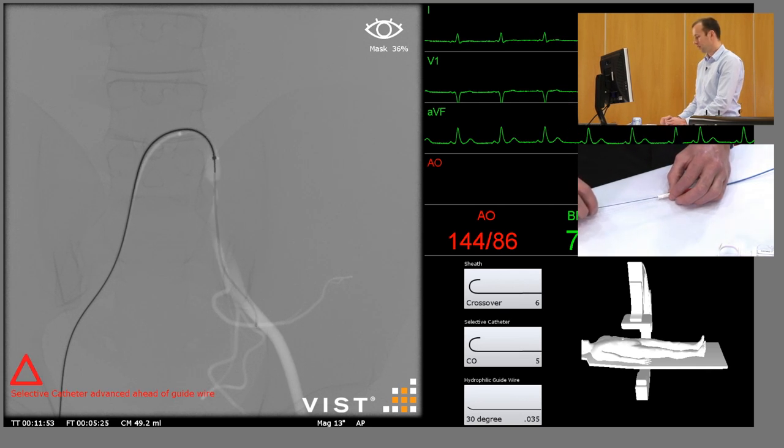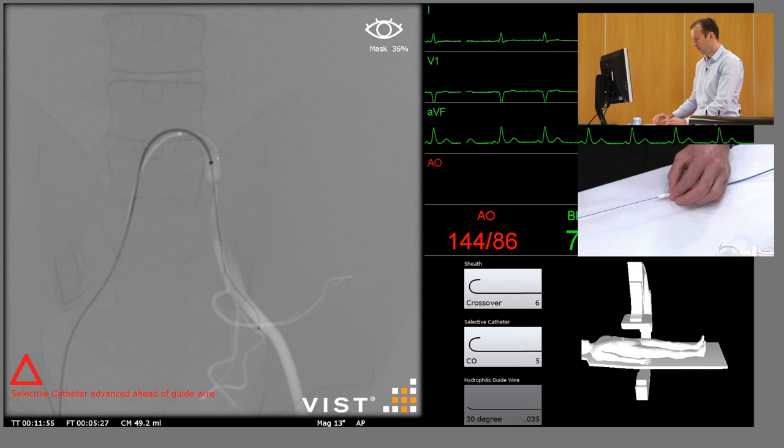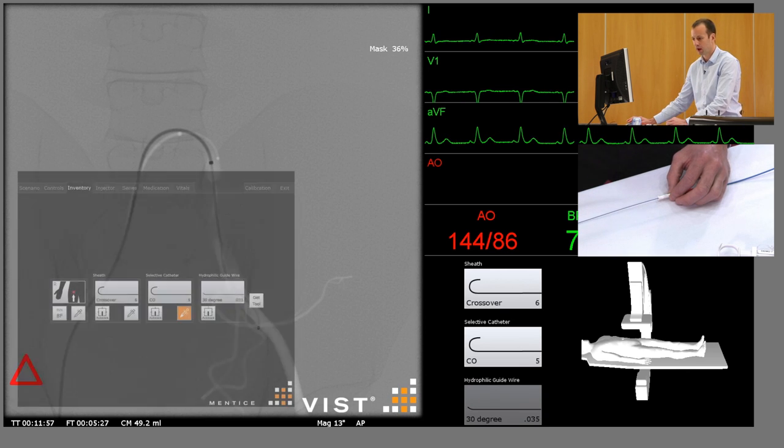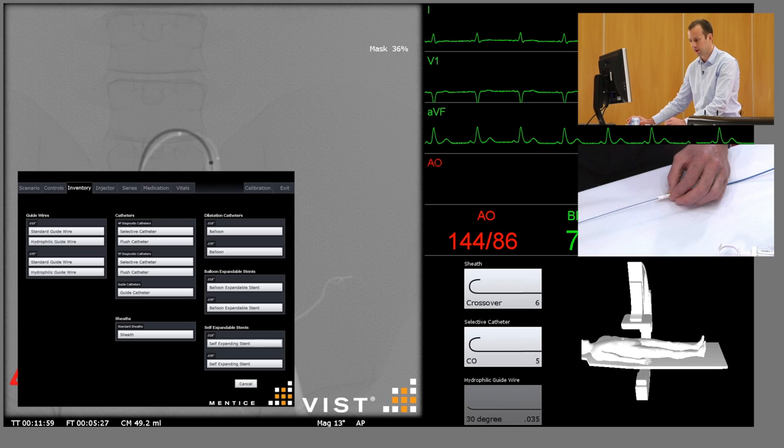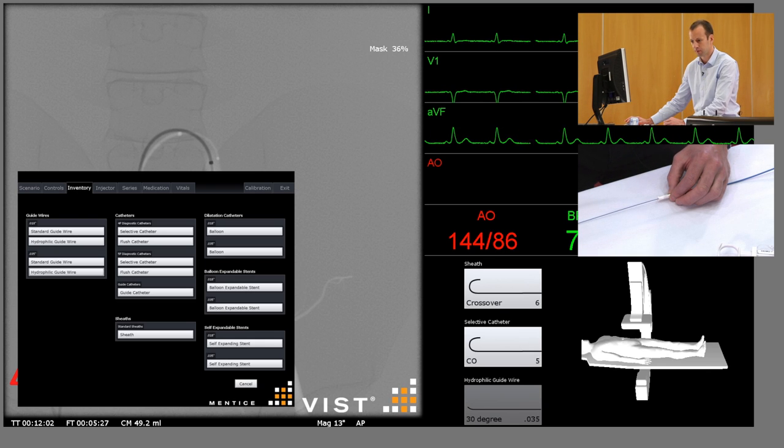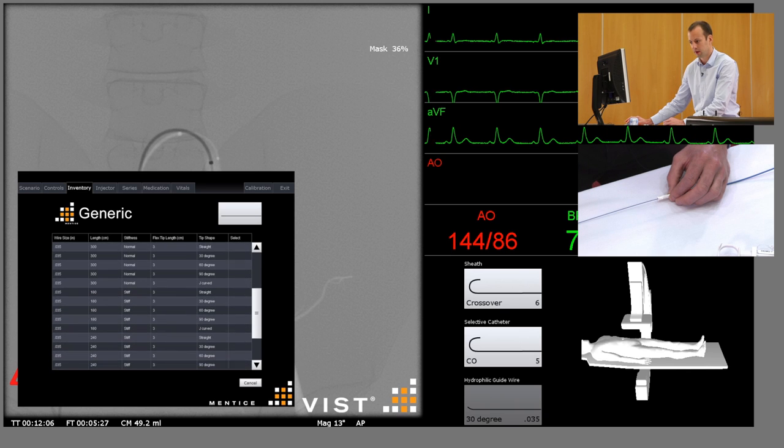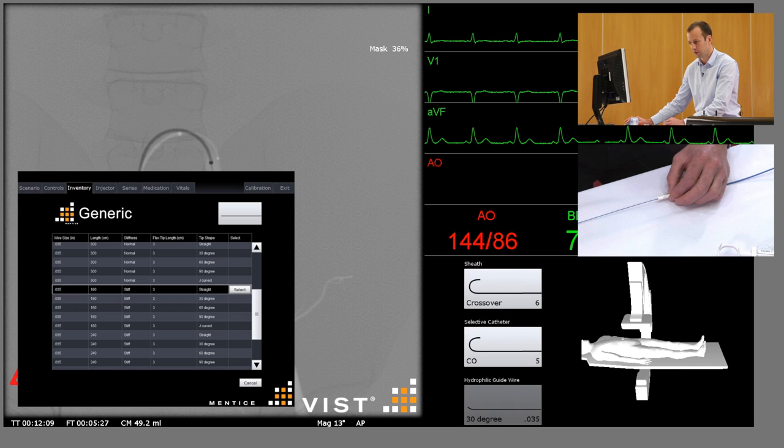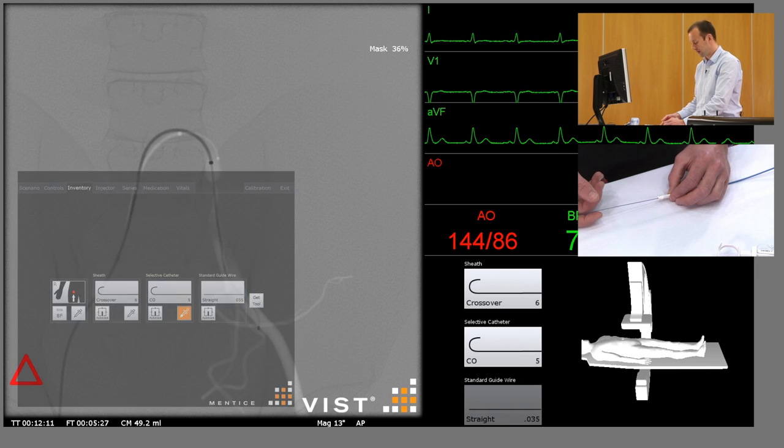At this stage we'll remove the hydrophilic guide wire and replace it with a stiff non-hydrophilic wire, which will give us far more support and allow us to treat the lesion more safely.